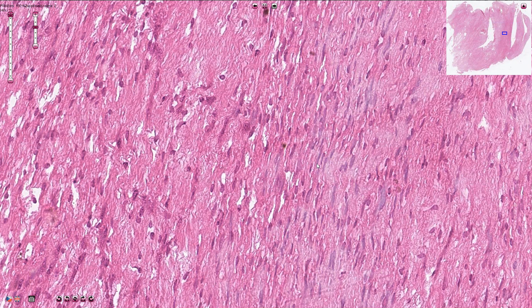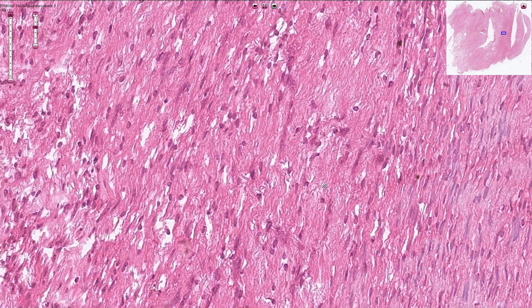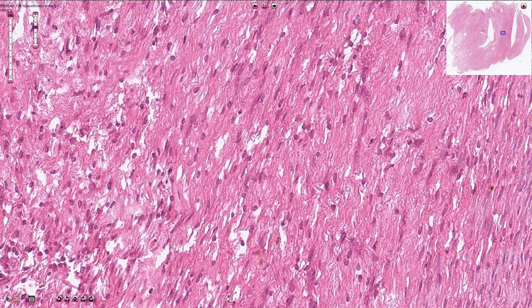This is an example of the area of slightly higher cellularity. We can see that the cells are elongated and the nuclei are spindle shaped. Sometimes the nuclei are compared to bullets because they have one end which is sharp and the second end which is blunt. Some of the cells are also slightly curved, which is the typical appearance of Schwann cells. In between the cells we typically see this fibrillary eosinophilic material.